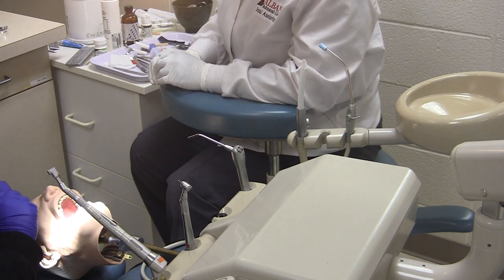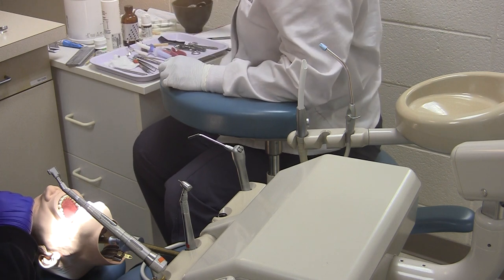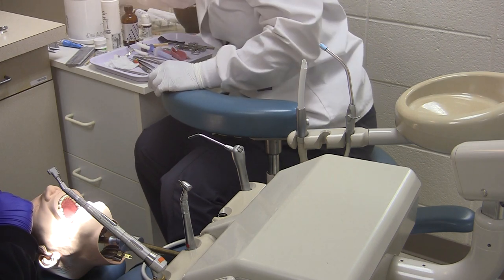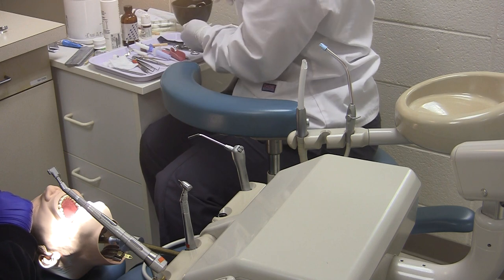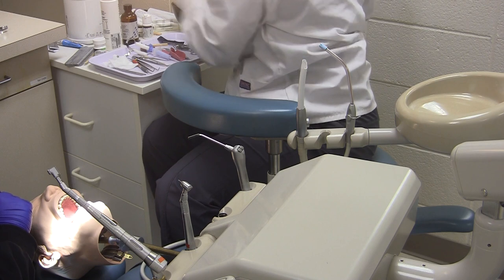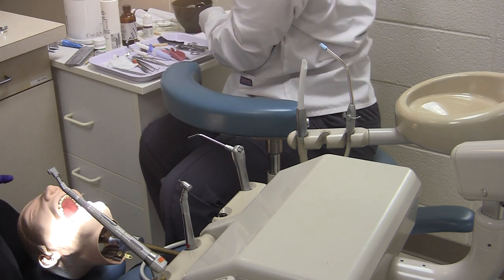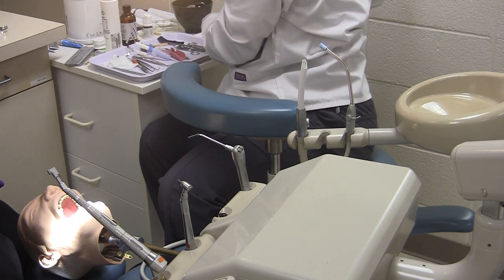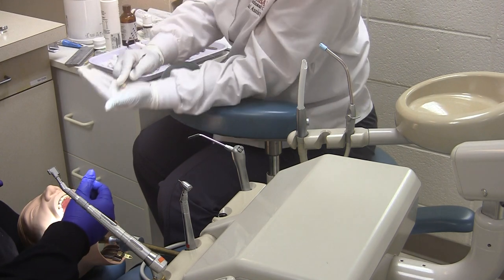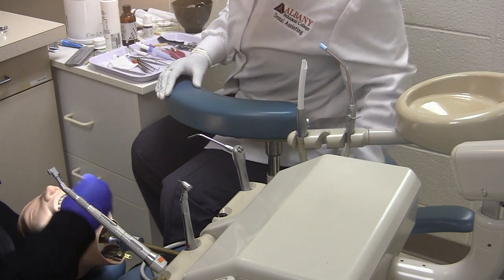We would then move forward by cementing our temporary in place. The assistant would mix their temp bond, load the cement into the temporary crown, and pass it to the dentist. This is also an expanded function that a dentist might allow you to perform.